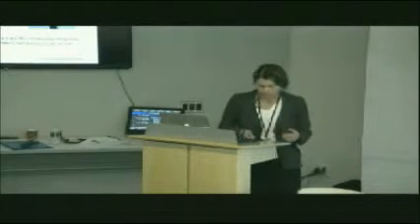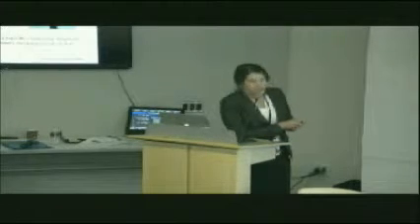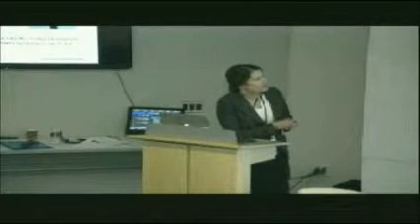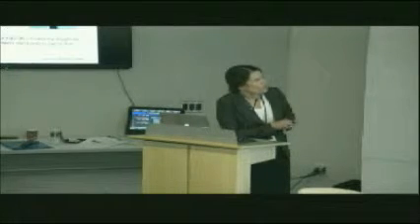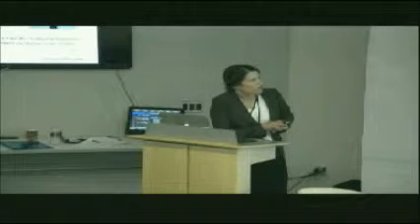I'm showing here a picture of a figure-8 coil, and this is the box that essentially provides the energy to this coil. This coil will be put on a person's head, and it induces a change in the magnetic field. So this box essentially puts out an electrical pulse. You put it on your head where you want it.